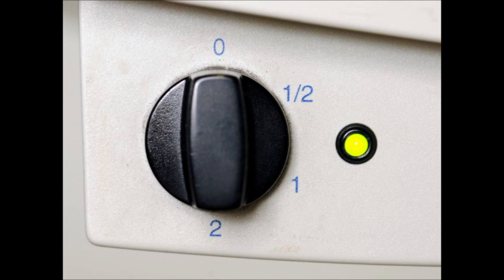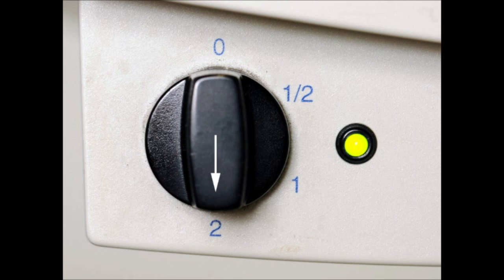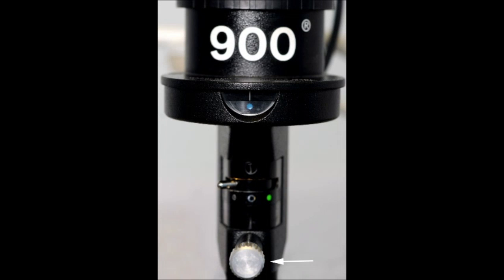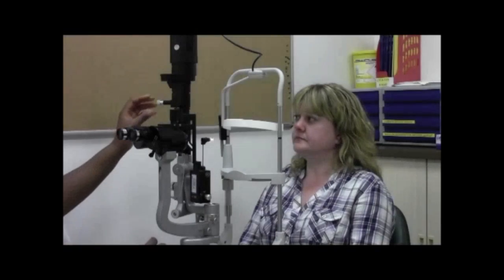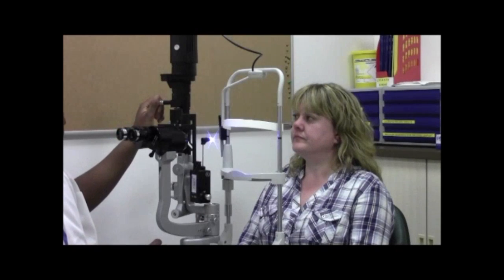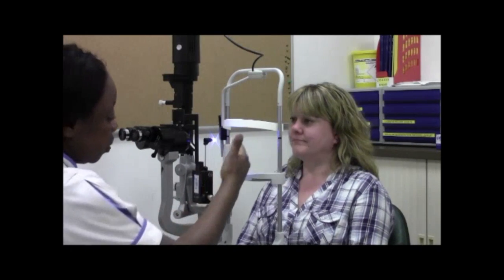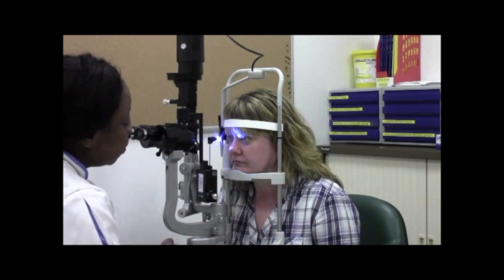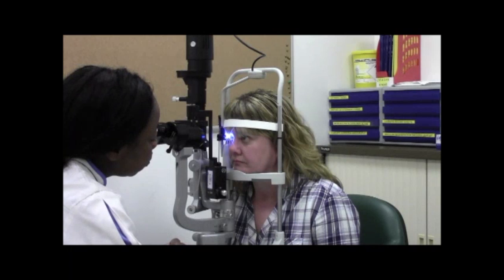Turn the slit lamp on using the on/off switch, then turn the black knob to maximum brightness. Turn the knob below the light filter tray anti-clockwise to B for the blue light. Ensure that the light is at its brightest by adjusting the illuminating knob at the base of the swinging arm. The blue slit beam light should be shining on the tonometer head from the temporal side. Use the joystick to move the slit lamp backwards, forwards, sideways, and up and down.